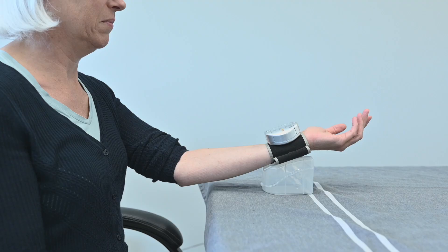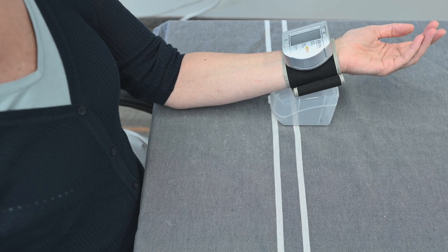While the measurement is being taken, do not speak and do not move. Try not to tense the muscles in your measuring arm.